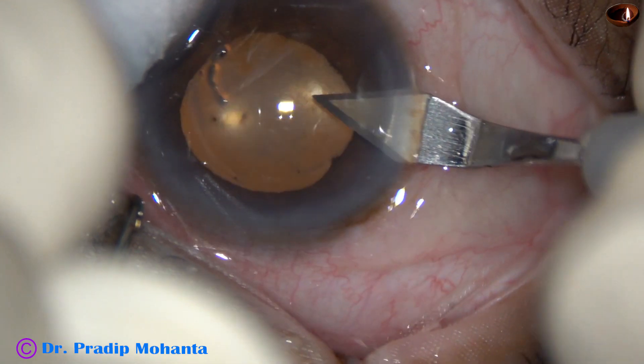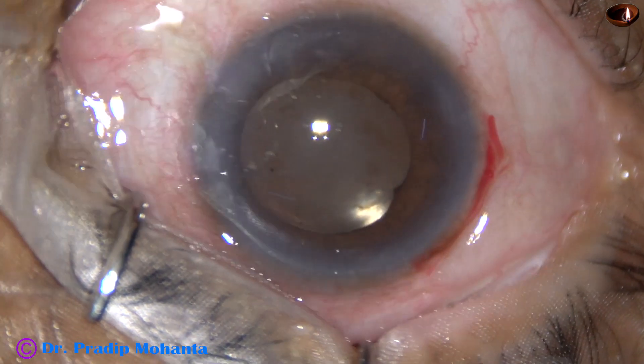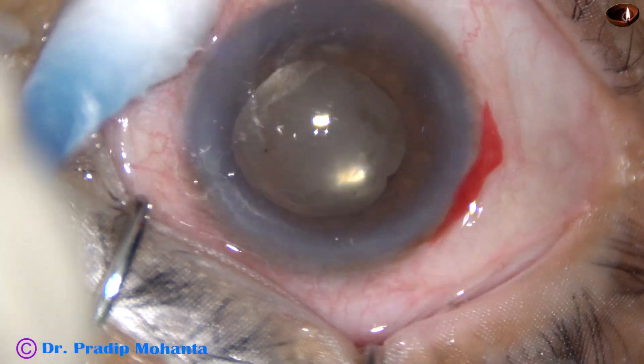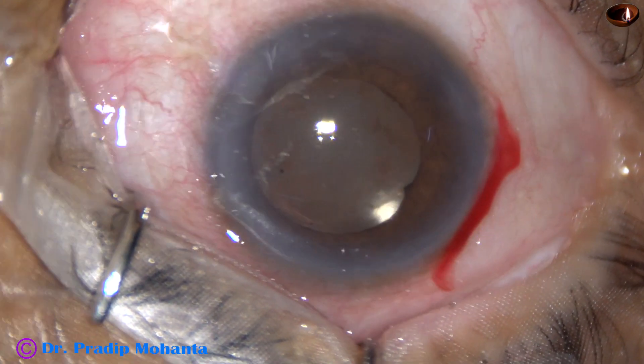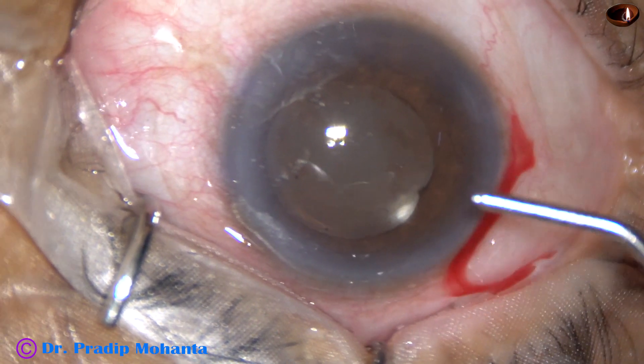After several weeks of conservative treatment with steroids, I have decided to surgically remove the inflammatory membrane.